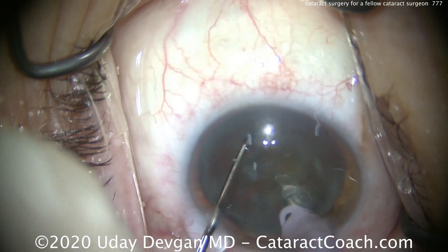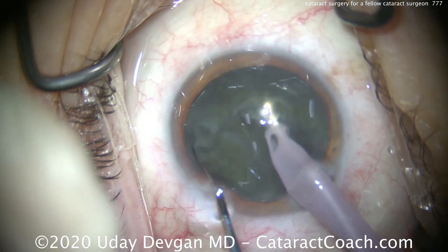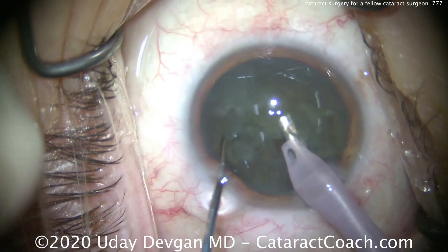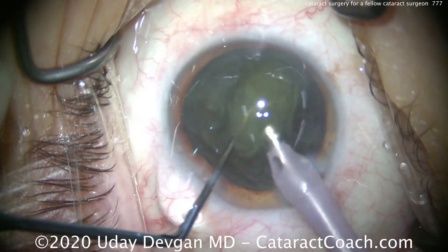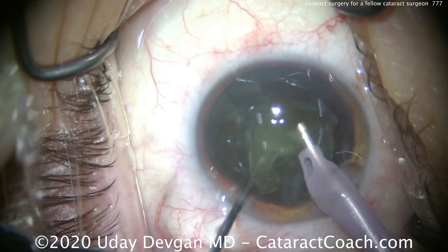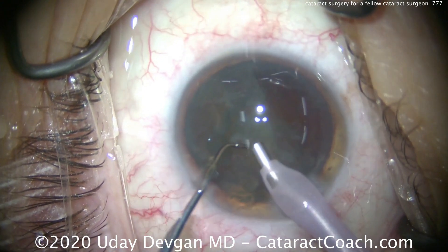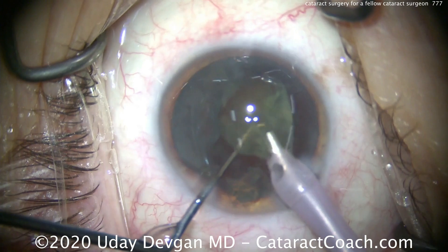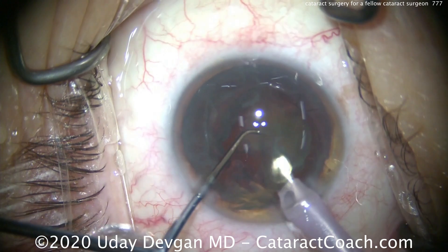Very little energy is going to be required to remove this lens nucleus — it's not super dense, and we're going to use a lot of chopping technique. Clean up that anterior cortex; buzzing with the phaco probe, chopper goes in, and now we've got two halves created. Because the cortex has opacified, the view is not great, but it'll clear up as soon as you start to remove the lens material. There's the first half of the nucleus, brought up to the iris plane and gently emulsified.